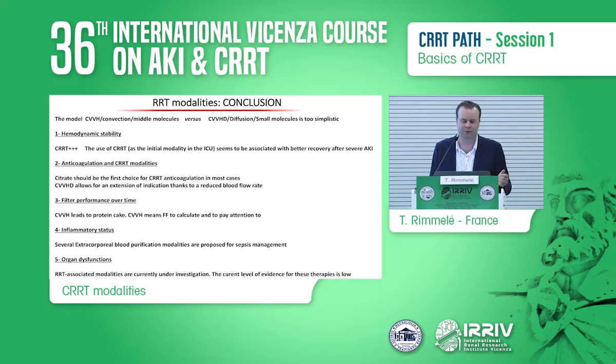The filter performance over time, again, CVVH leads to the protein cake because of the issue with the filtration fraction. Don't forget to calculate your filtration fraction when you prescribe CVVH. The modulation of the inflammatory response, we're going to talk a little bit later about this during the meeting, and other organ dysfunctions. The current level of evidence of these modalities is low at this time.